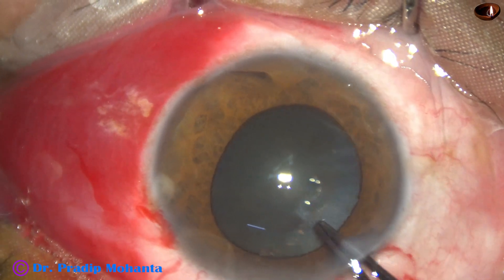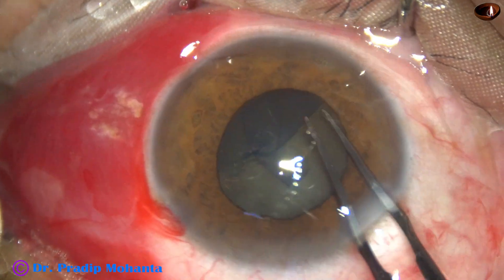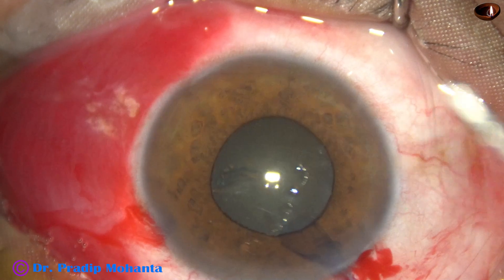I take utrata forceps and do the rhexis. As I complete the rhexis, I find that the pupil has started to become small.